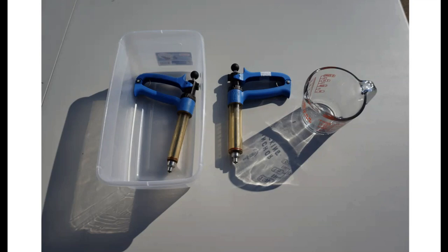As long as it's covered in water, never had any issue with that. For the newer microwaves, if you look at them, a lot of them actually have a metal rack in them. So just be aware of that, but that's something you have to decide if you're comfortable doing or not. If you're not comfortable using the transfer needle in there, then what you can do is get you a new wooden toothpick and just use that every time. And so that's the way we go about cleaning those.